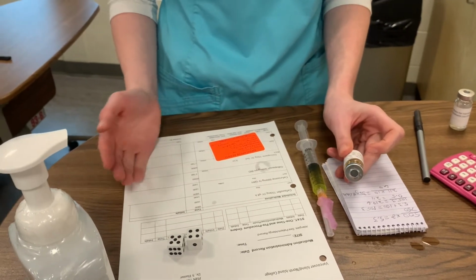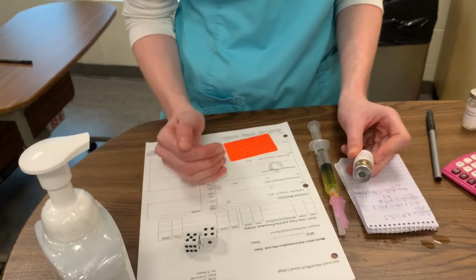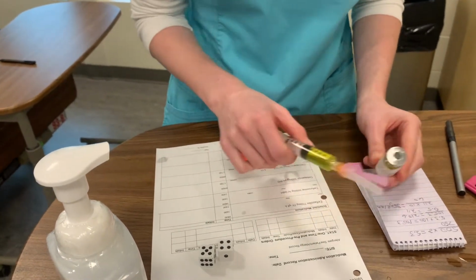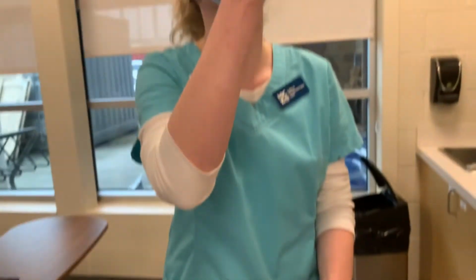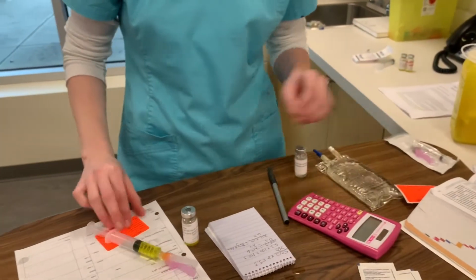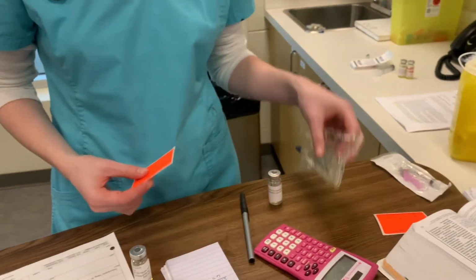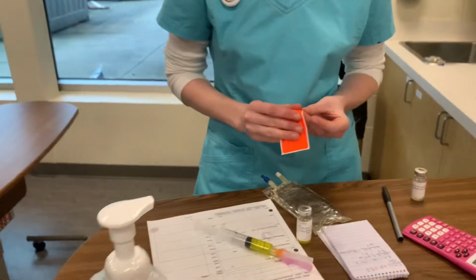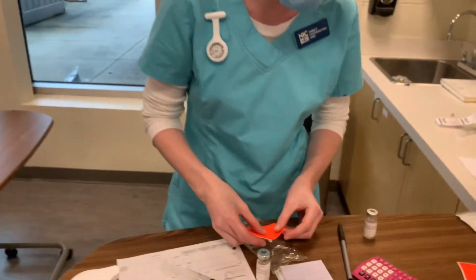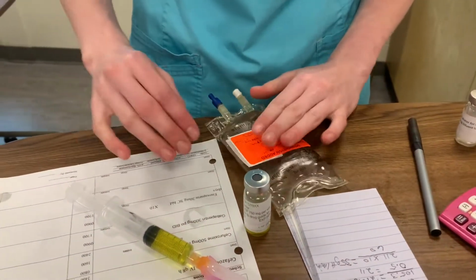Here's the documentation on January 19th, 2021. And I have 5.3 mils. Yes. Now I'm ready to add it to, I'm going to put the sticker on the dextrose D5W, and I have double checked that it is a safe diluent for it.